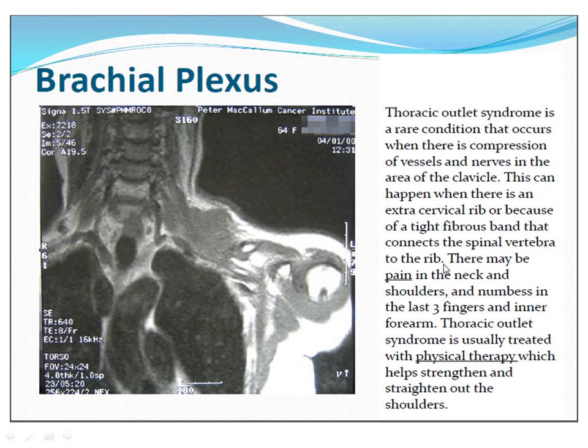This is just a slide mentioning thoracic outlet syndrome. You may be doing brachial plexus MRI occasionally. There's a variety of different conditions that can affect the brachial plexus. This one mentions thoracic outlet syndrome because that can definitely affect the brachial plexus. And sometimes you may even be asked to evaluate the brachial plexus in different positions, because the patient may have symptoms in different positions, whether they have their arm up or down.